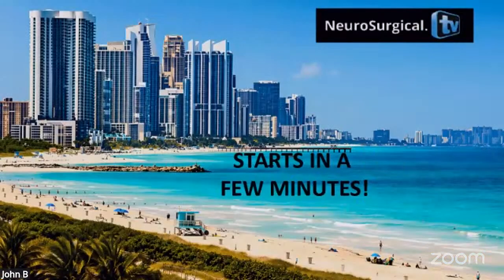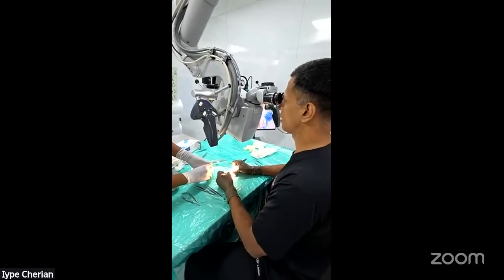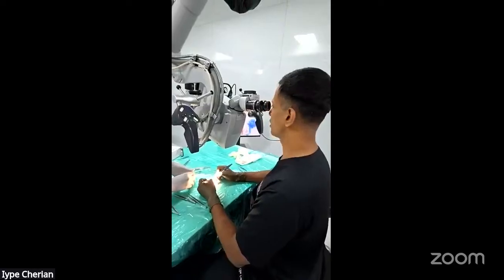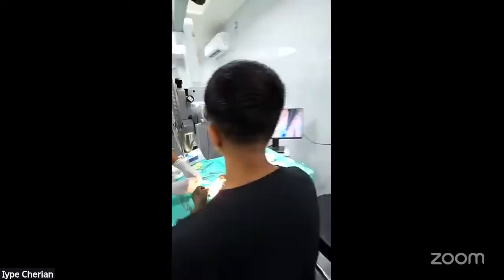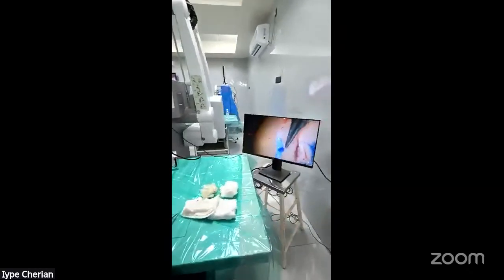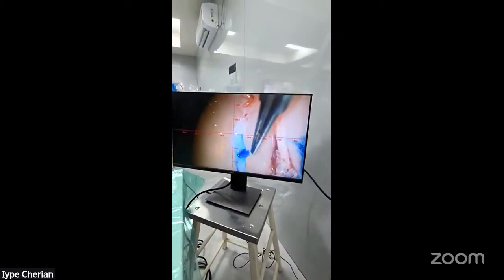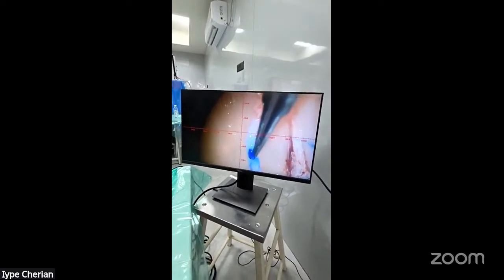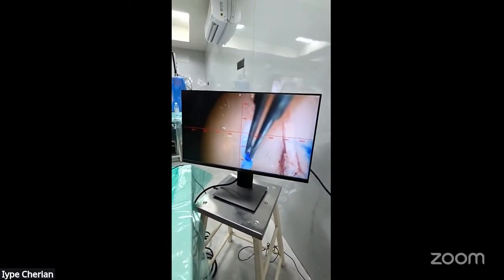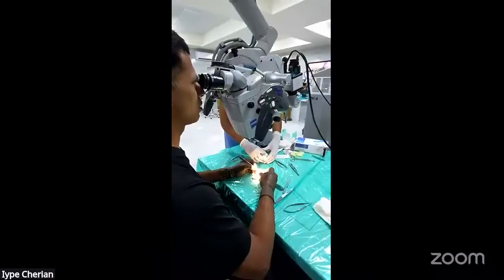We are doing many things now. First thing is a patch on a vessel, so you can see the feed of the patch. This is a 0.6 millimeter vessel, and we are demonstrating that sometimes when there is a large tear, how do we put a patch? So you can see the patch there.